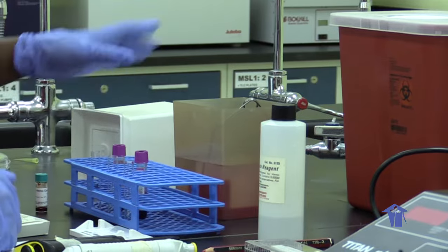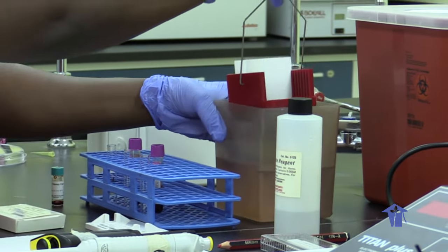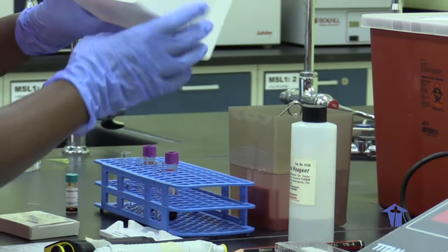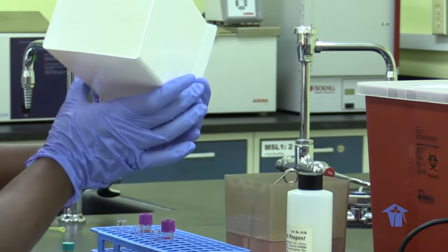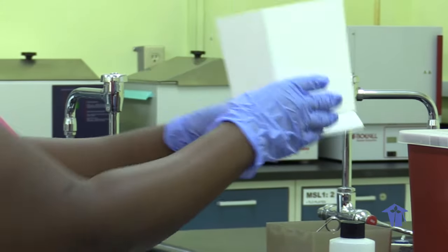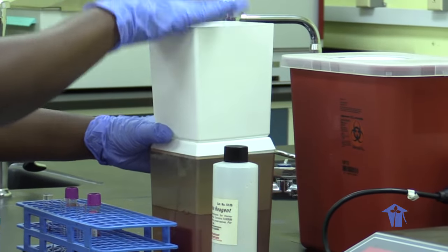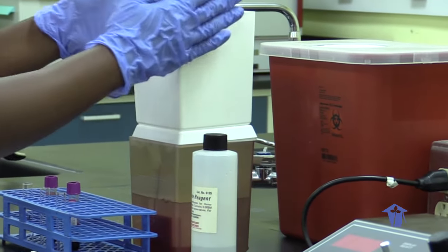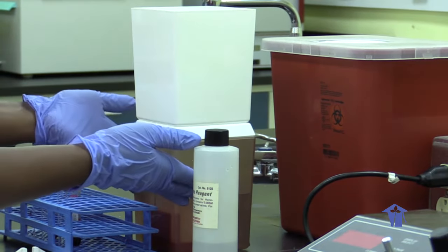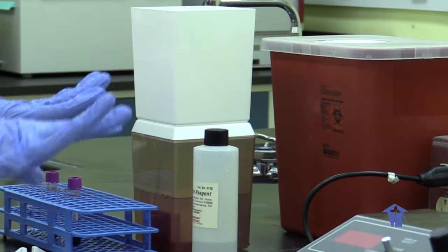This is basically how we put it on the sample racks. We place it in the empty container and then place this on top. This has an aperture, a small hole there, that we fill with the Super Heme buffer, and it gently runs down on the plates, eventually reaching up to the level of the plates and soaking them equally, or evenly.